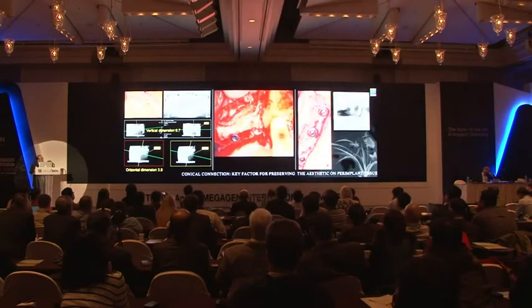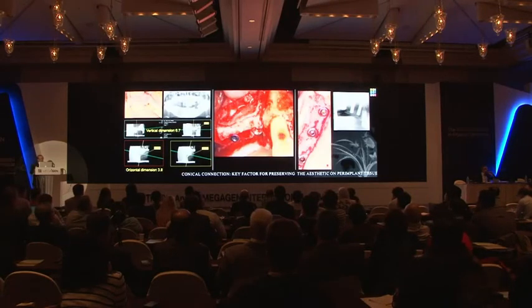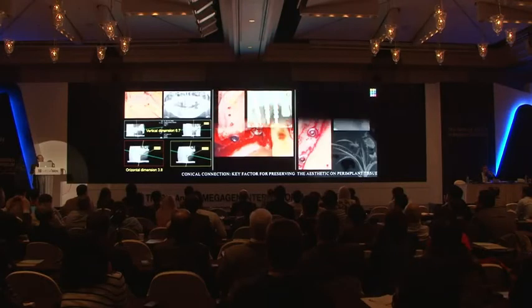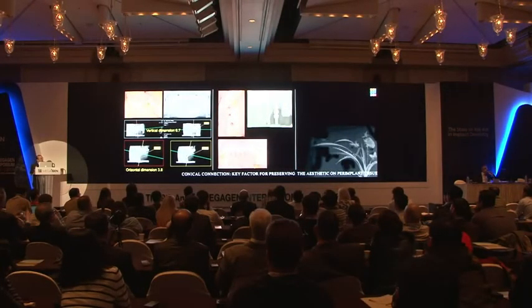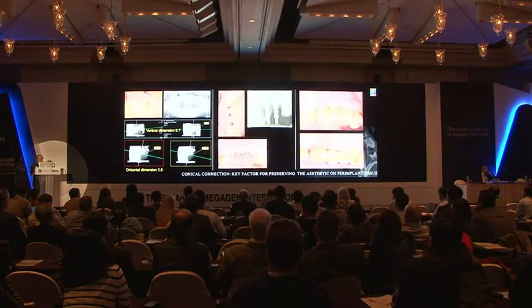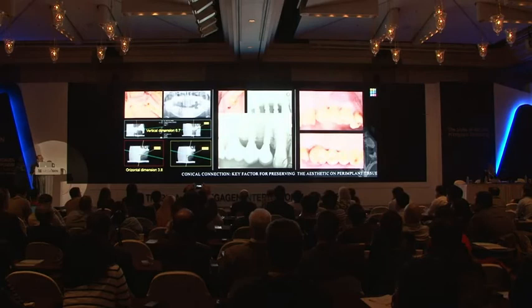You can see what a good quality of bone we managed to obtain. And look at the quality of the soft tissue. And this is the final prosthesis, rehabilitation, and the RX control after 1 year of loading.